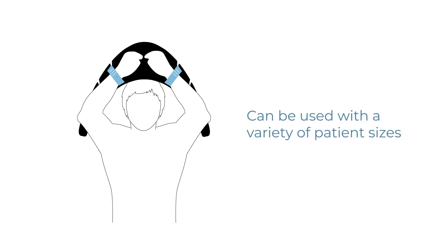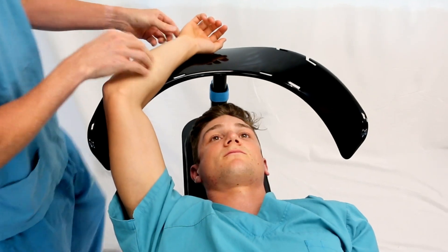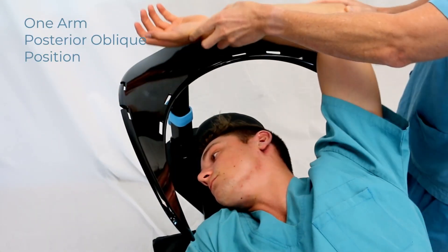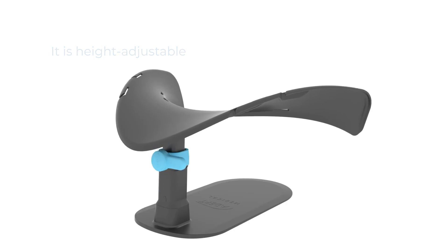The overhead arm support can be used with a variety of patient sizes and for an array of procedures. This versatile device will support one or both arms in the supine position and a single arm when used with the posterior oblique position. It is height adjustable and can be set to an optimum position using a one-handed lever locking mechanism.